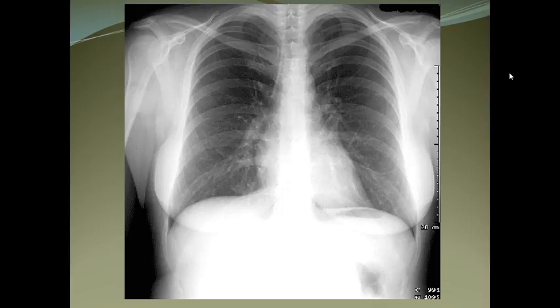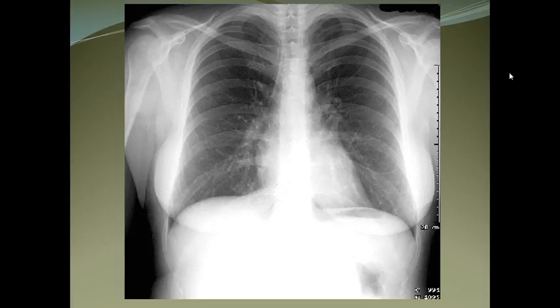In AP chest X-rays, multiple abnormalities can be hidden by the apparently enlarged heart, which is actually not enlarged. In the AP view, the heart shadow is so much bigger that it obscures fine details and many pathologies.